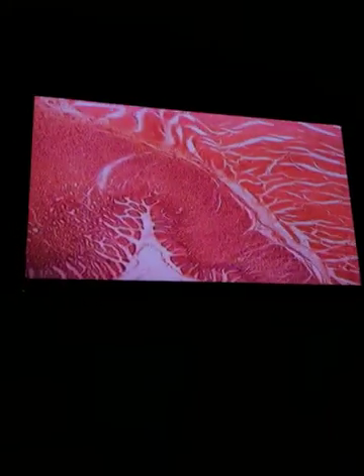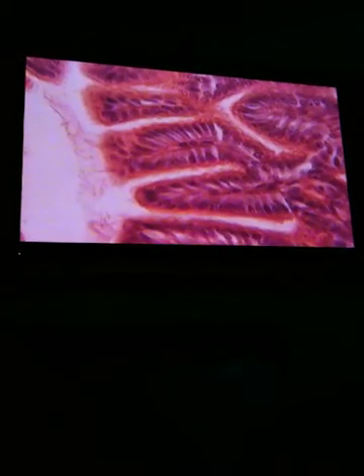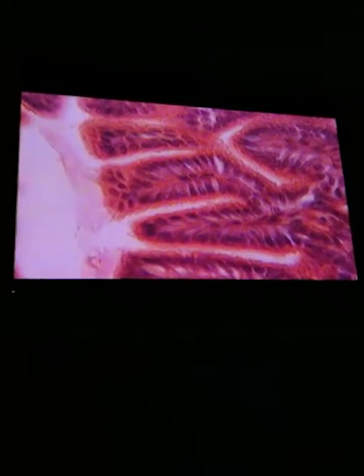Now if we get closer and take a closer look at the tissue, this becomes a little more clear, and you can start seeing those columnar cells. Let's get out here. There we go. So what you're looking at now is inside the stomach. These are the rugae, and you have gastric pits in the stomach.